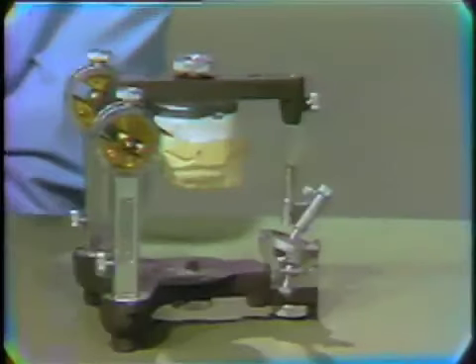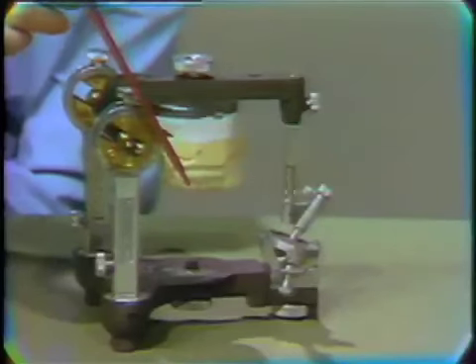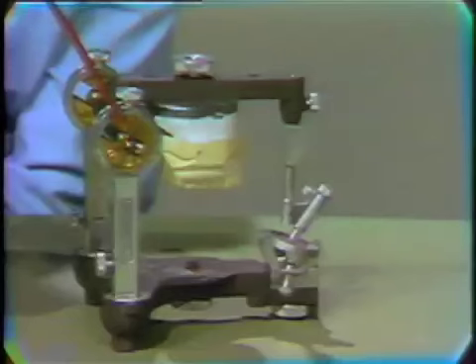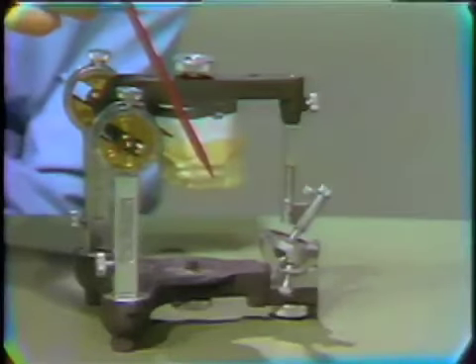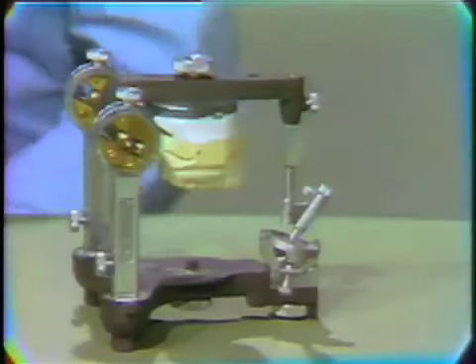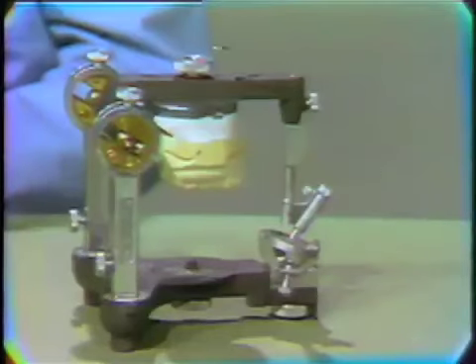After we've mounted the cast on the articulator, these teeth should be the same distance from the axis on the articulator as they are in the patient's head. If they are, then we would be able to mount the lower cast on the articulator in relationship to the maxillary cast, which is in relationship to the hinge axis.